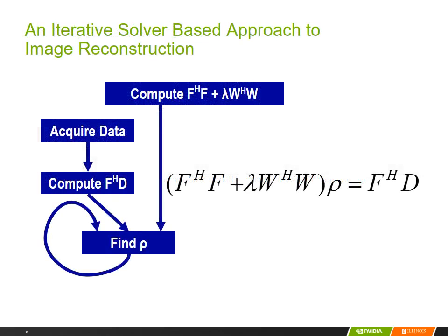Now that we understand the motivation and basic principles of the non-Cartesian MRI reconstruction, we can now look into the details of its computation methods. Here we show the formulation of the computation method for reconstructing a non-Cartesian MRI scan. The middle of the slide shows the equation, which is the basis of the computation method.